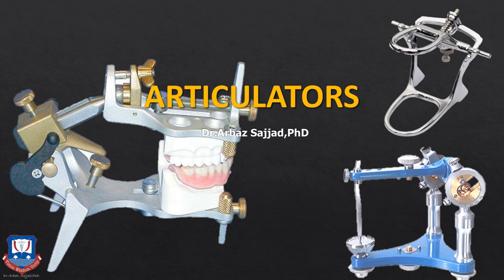The whole purpose of all these lectures, or all these steps in complete denture, is to ultimately make a prosthesis that fits well in the patient's mouth and is well adapted. For this to happen, we have something called articulators, which simulate the patient's temporomandibular joint and his upper and lower jaws. All these previous steps, which are the centric relationship records, the orientation relationship, the vertical relationship, and the use of face bows, are done so that we can mount the patient's models in the articulator.